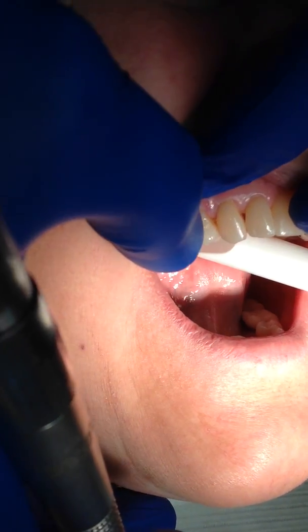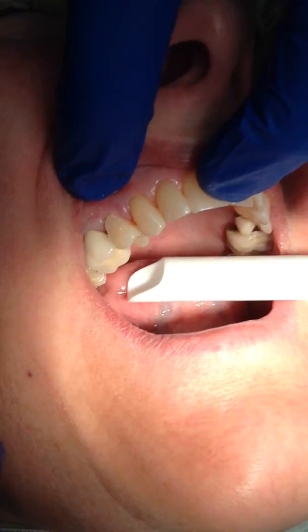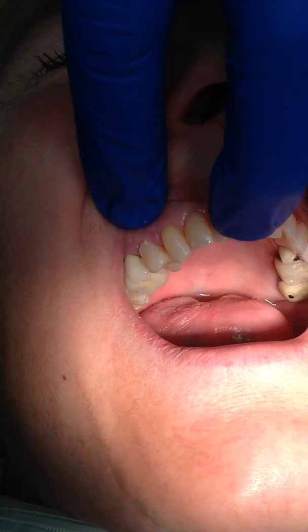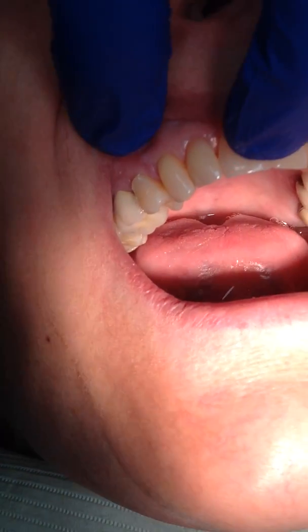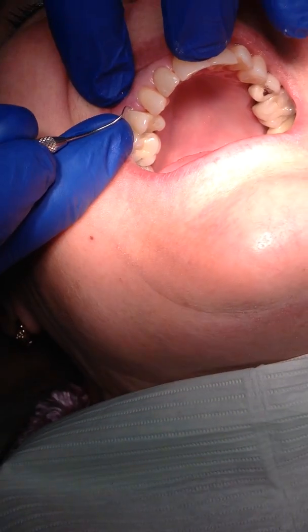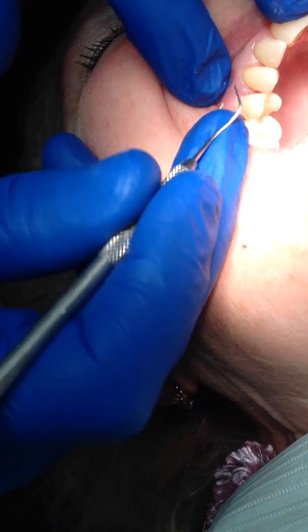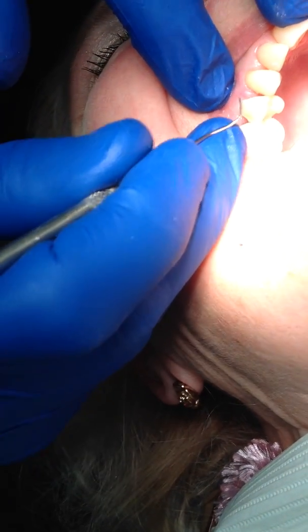And what we end up with is this kind of restoration. Obviously there's a point here that needs to be trimmed up. But the big advantage is that when you look at the gingival aspect of this tooth, how beautifully smooth it is down here, and how it looks like the height of contour. We were just able to move the height of contour down to the tooth.